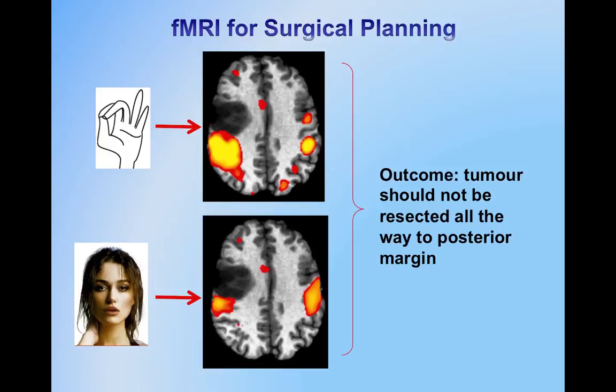So in this case, there was a chance that the patient may have a surgical deficit because their activation was so close to the tumour, and because this tumour wasn't life-threatening, it was just giving them epilepsy. Effectively, they opted not to have the surgery because they said they'd rather live with the epilepsy rather than go through the chance of having loss of control of their arms or their hands, or not being able to talk because of lost control of their mouth.